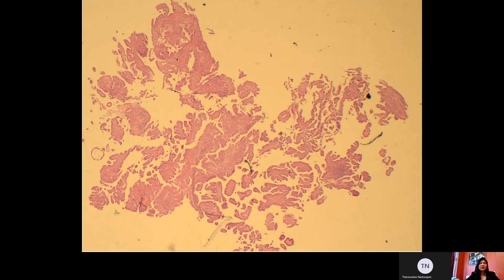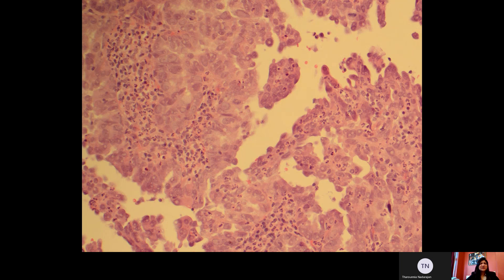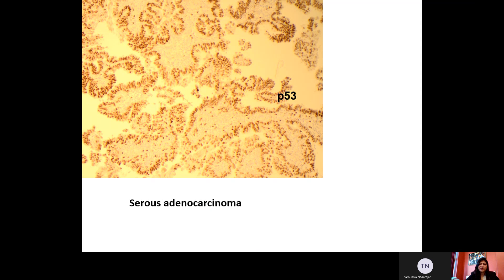This is a high-power view of the same case which shows high-grade rounded nuclei with prominent nucleoli. There is some hobnailing as well and the nuclei can be seen on the apex. This is an aberrant staining of P53 with most of the nuclei staining positive. This case was negative for ER, PR, and Vimentin.